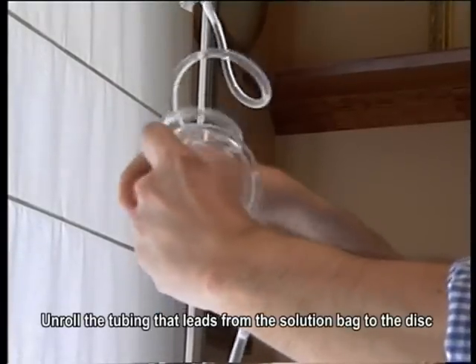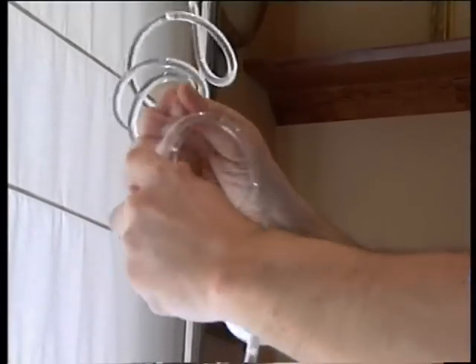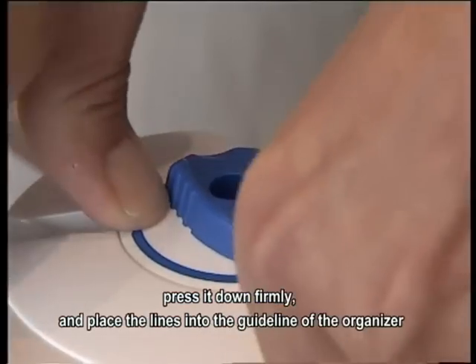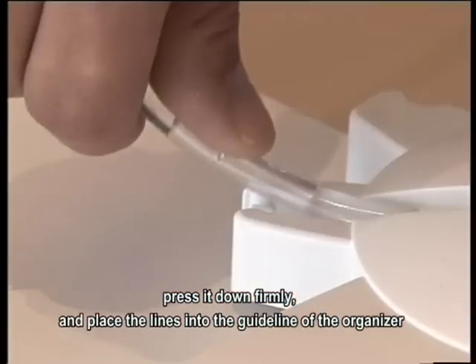Unroll the tubing that leads from the solution bag to the disc. Place the disc into the organizer, press it down firmly, and place the lines into the guideline of the organizer.